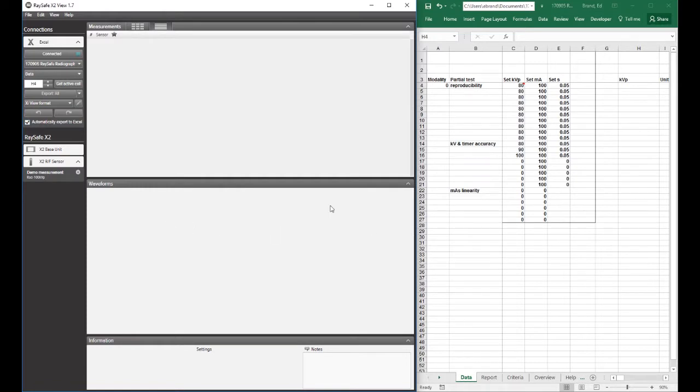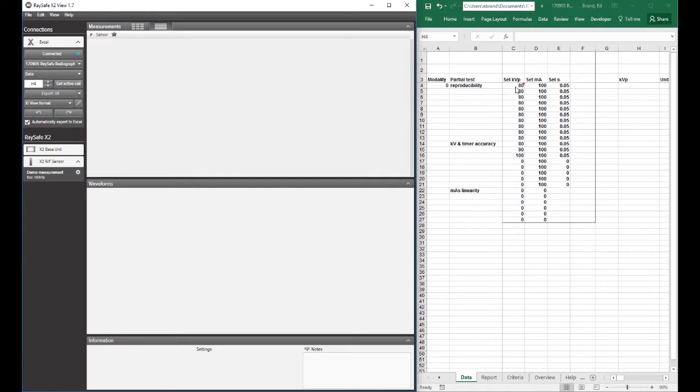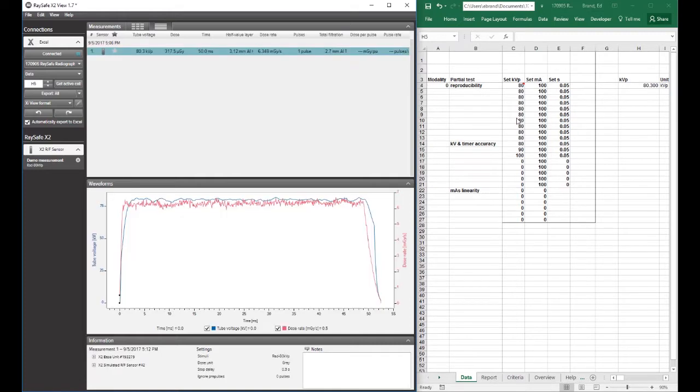So what I'm going to do is I am going to simulate an exposure. So you'll see the data populate in XIView, but you'll also see it immediately populate in Excel. I'm going to simulate an 80 kV exposure because what I'm going to do first is my reproducibility test.